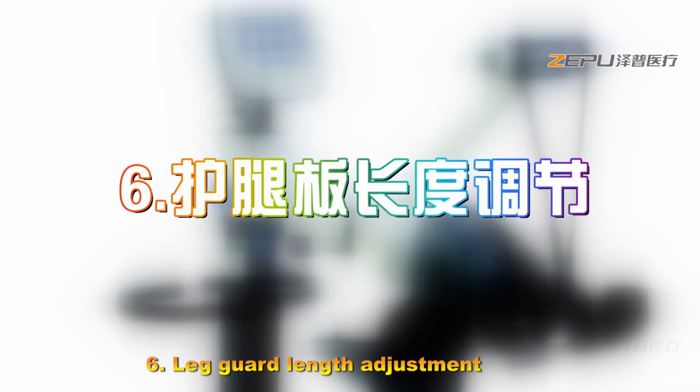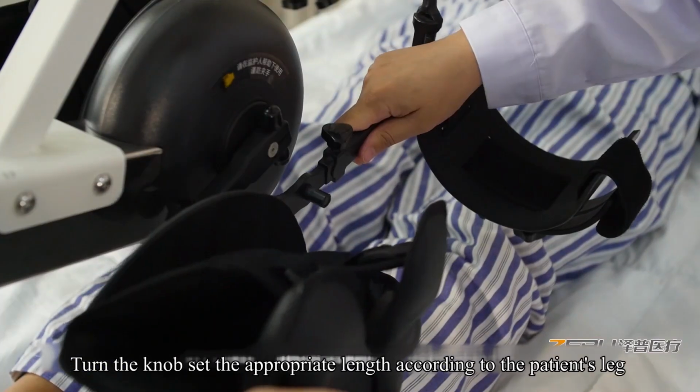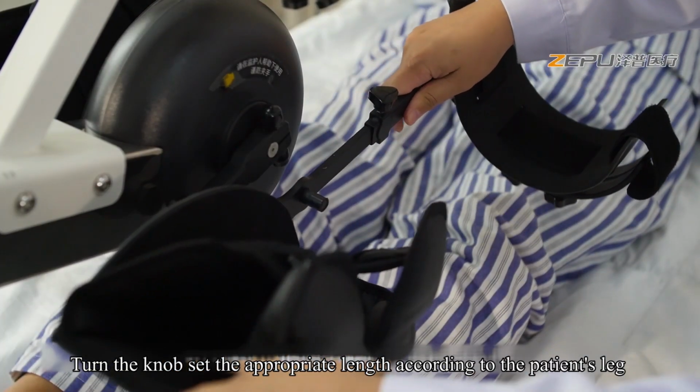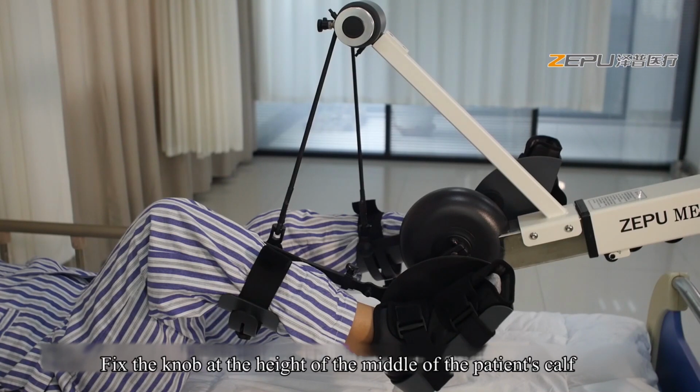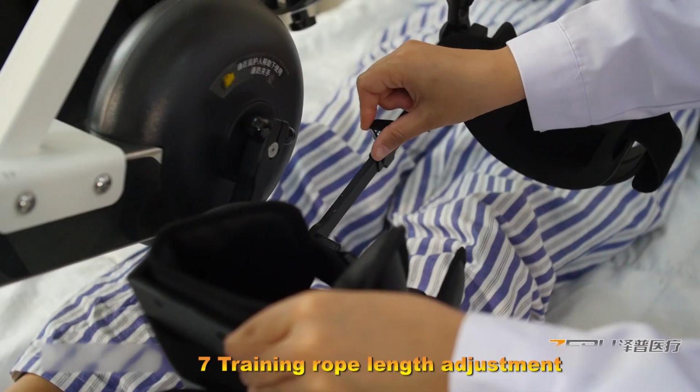Six, leg guard length adjustment. Turn the knob and set the appropriate length according to the patient's leg, with the height at the middle of the patient's calf being suitable. Fix the knob.